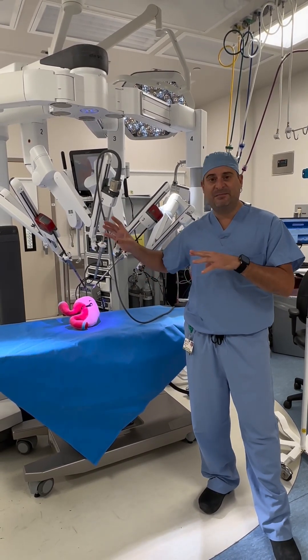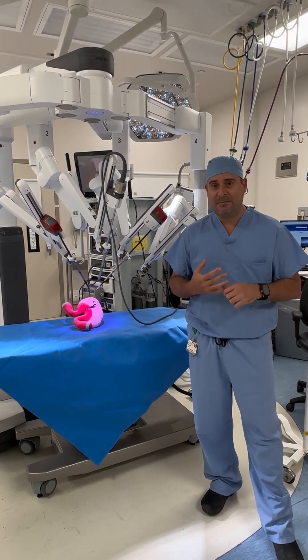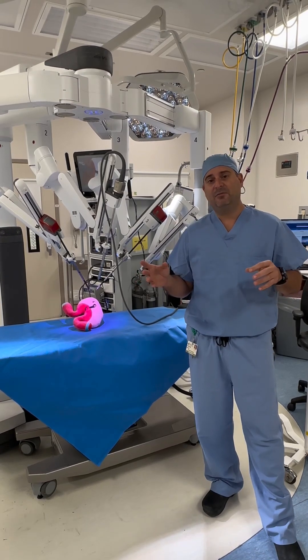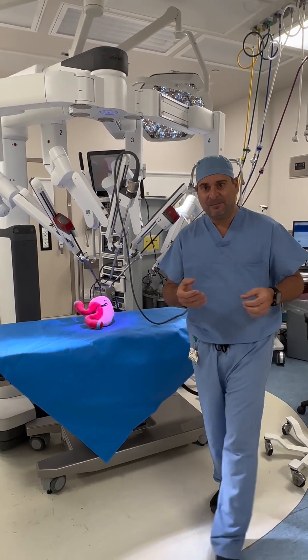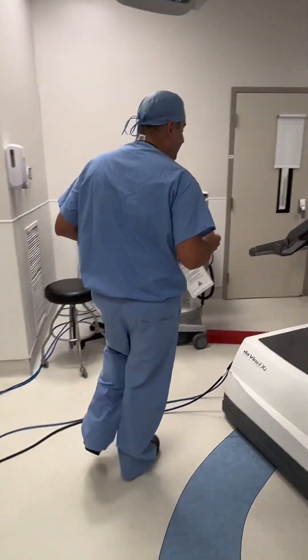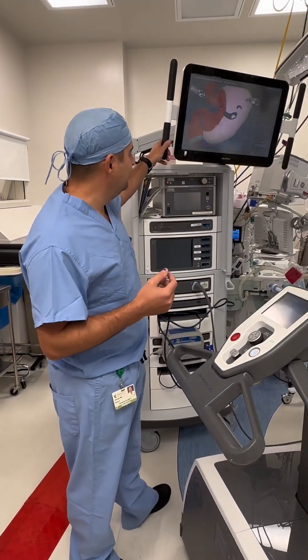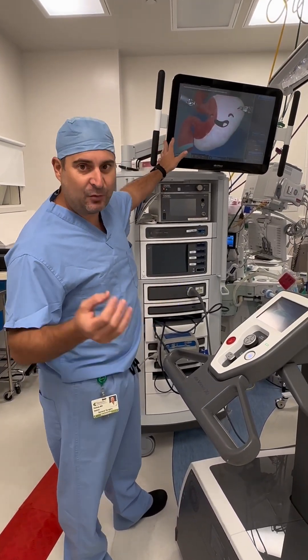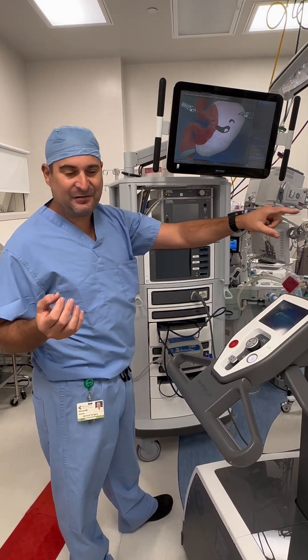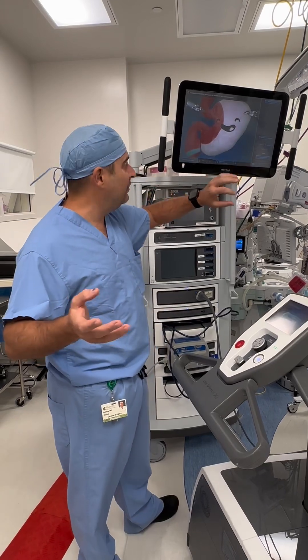You can think of the robot as being a direct extension of me as a surgeon. There are three main parts of the DaVinci robotic system I want to talk about. The first part is the vision cart, and this is where everything gets processed from the robot. There's a camera that goes to the robot and connects here, and this controls all the video.